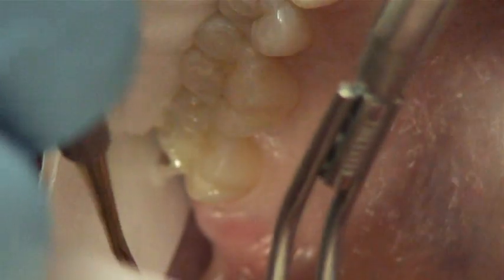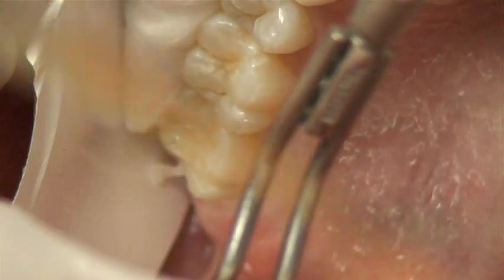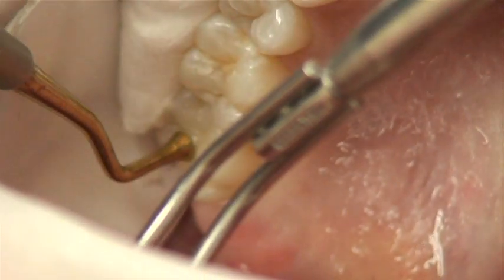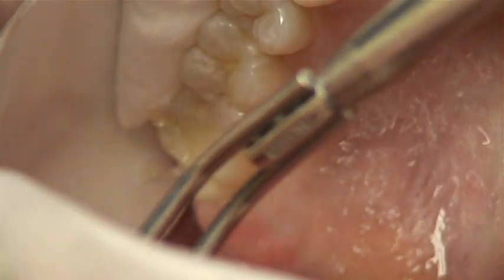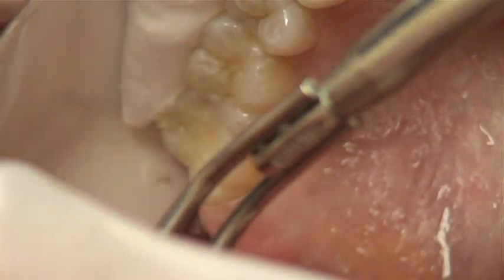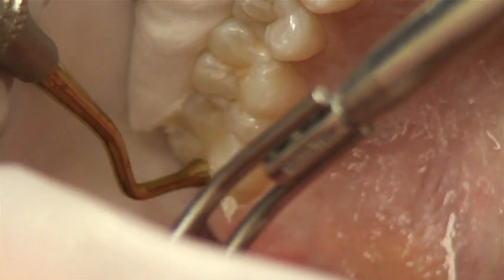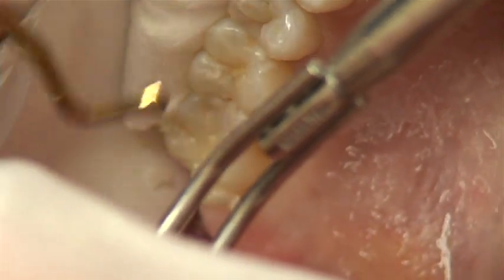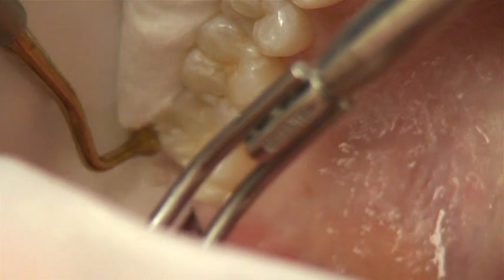Now you can see in this little video how I use a flat instrument. After applying that final increment, I use a little flat instrument to remove some of the excess, and then the final morphology is developed using the acorn. Now the acorn is used very similarly to the way we used an acorn when we were doing amalgams. The difference is that composite is a material that drags, so we cannot run the acorn from one end to the other of the restoration. We have to start in the center and then go to the end, following the grooves, allowing the anatomy of the remaining tooth to guide us.